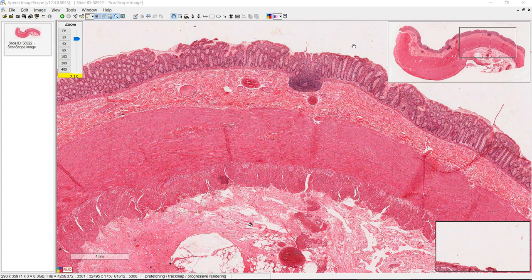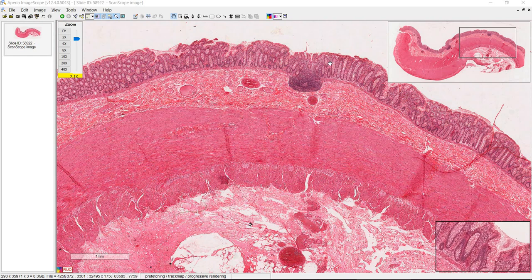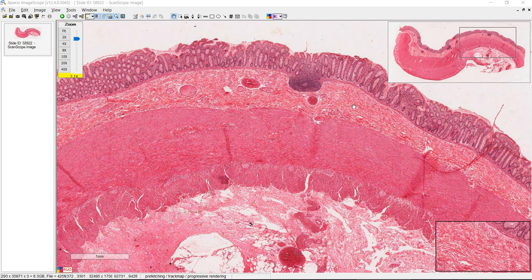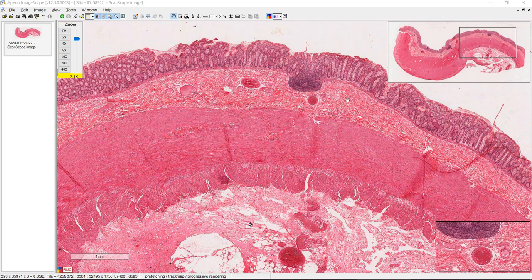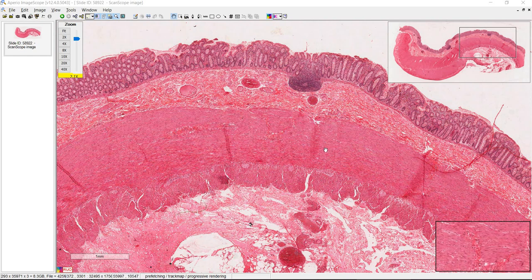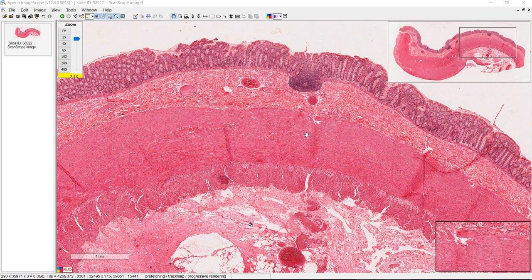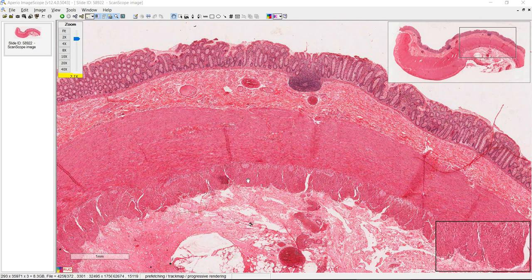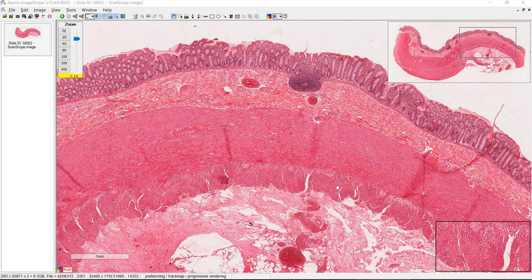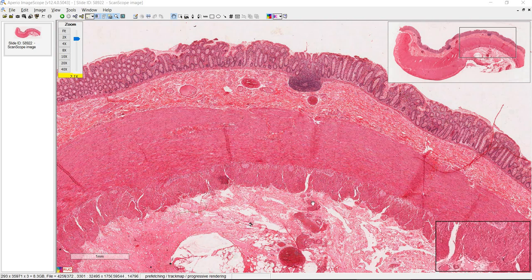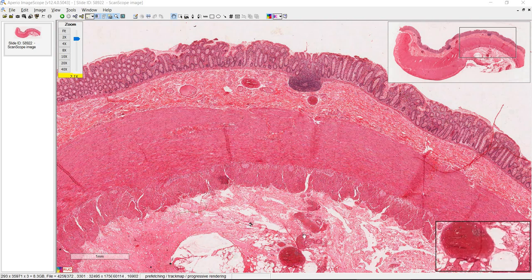This is the side of the colon. We have the lumen up here. This is the mucosal layer. Here's the submucosa and the muscularis externa with the inner circular layer and the outer longitudinal layer. And deep to that we have the serosa.